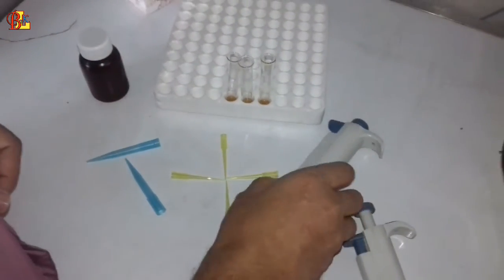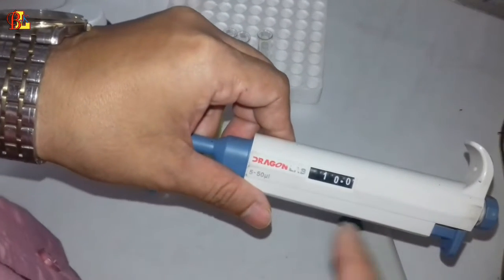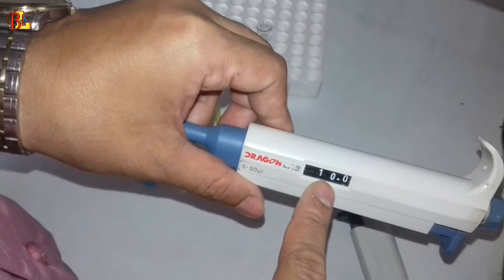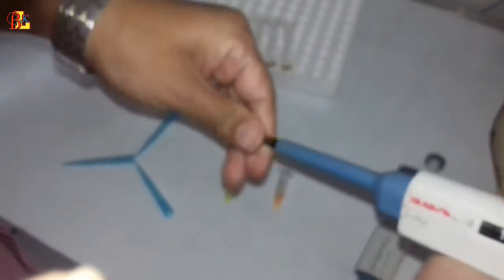Now we will apply 10 microliters of patient serum to all test tubes except the blank test tube. After putting the serum into the reagent in the test tube, we will see that the color of each has changed.